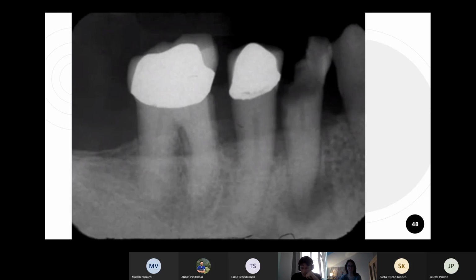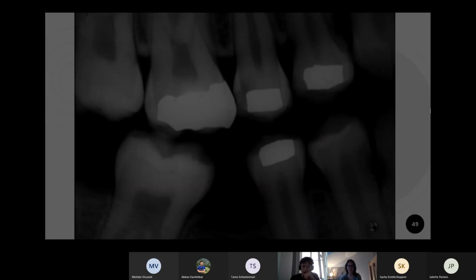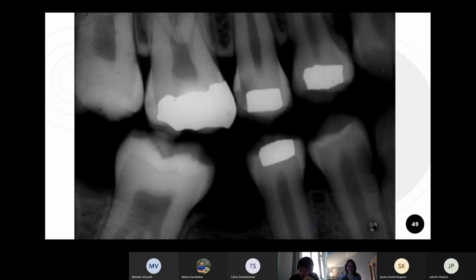In this case, you can see on 4-4 you have a periapical cyst, periapical lesion. It's quite a lot of bone resorption there. And of course, a lot of caries on 4-4. The whole crown is destroyed by caries. And on 4-6 and 4-5, you can see metalloceramic crowns. Or probably metalloceramic, could be resin, but definitely facet crowns. Just say facet crowns in the exam. That's more safe than saying metalloceramic. Okay, if I didn't miss anything, then we can go to the next one.